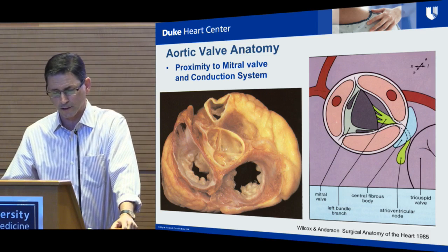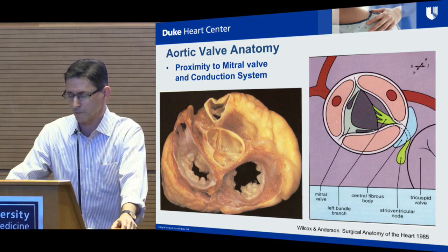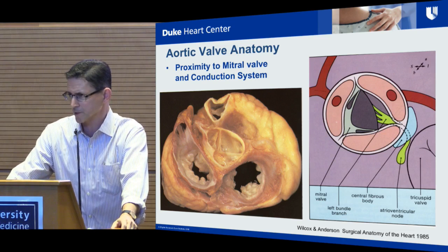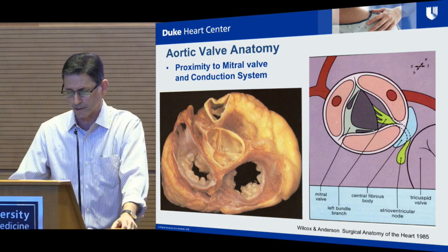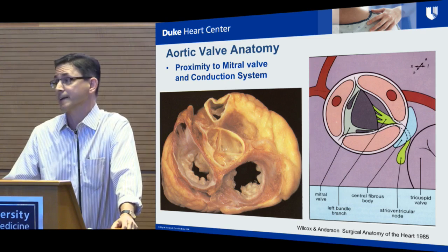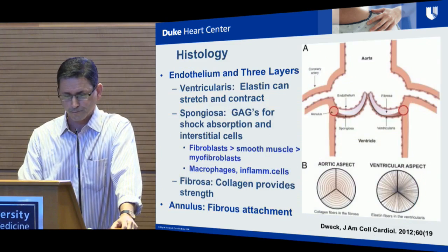So, the coronary sinus can be an access site to actually implant a device. And we just saw the IVC being used, and I've worked with groups that are looking at implanting essentially stents in the IVC, and that has its own list of risks and rewards.